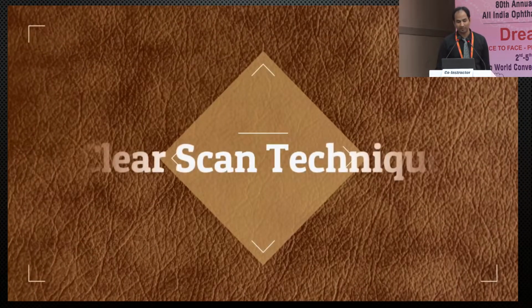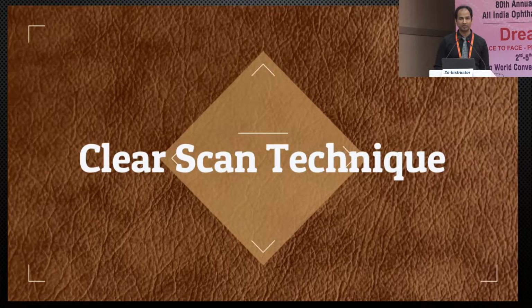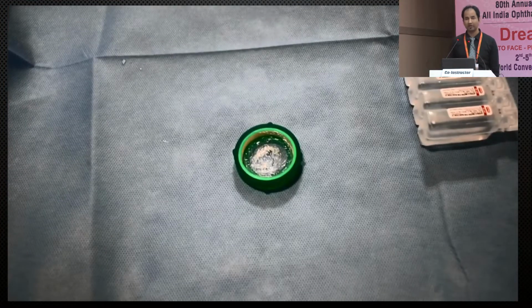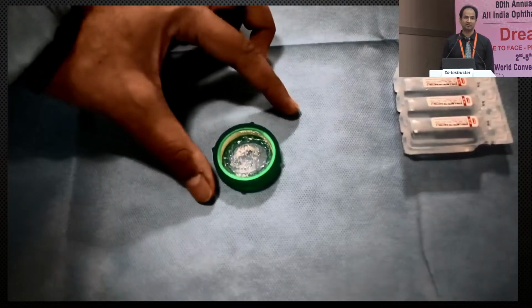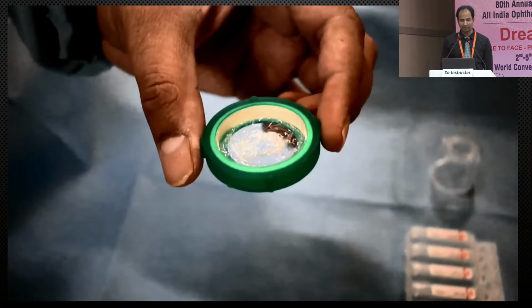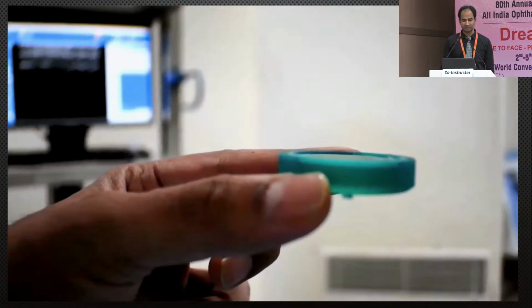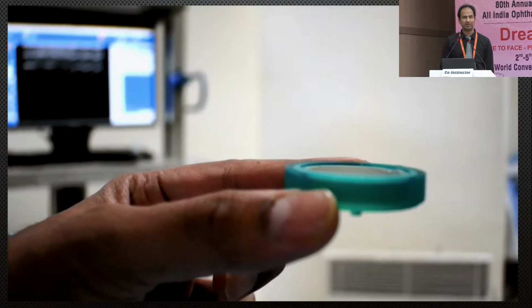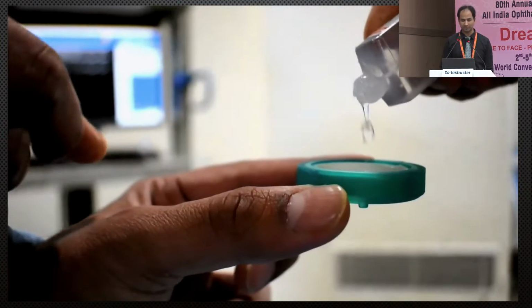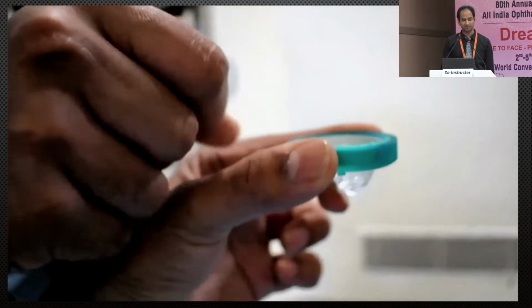Now I'll be demonstrating the clear scan technique. It is a very useful technique for children, and this technique can be used in supine as well as sitting position. So this is the clear scan cup. This is very delicate. The difference in both the techniques is the cost. This is a disposable cup, but it can be used multiple times. The company suggests single use. It is filled with distilled water.